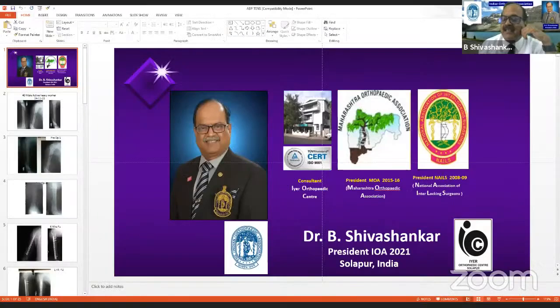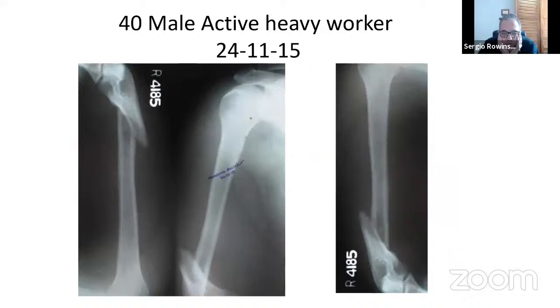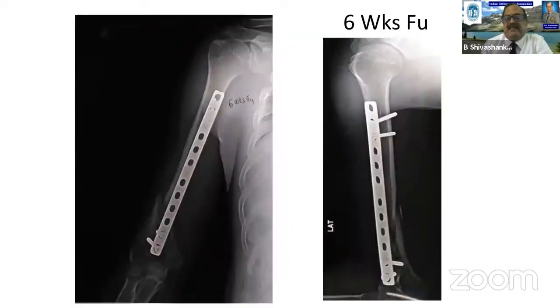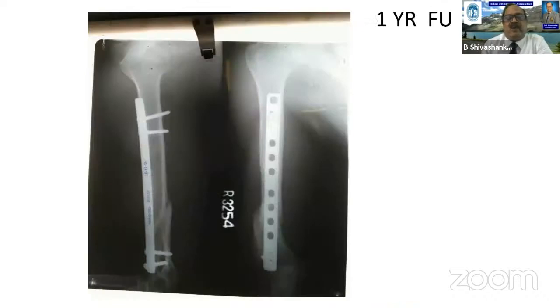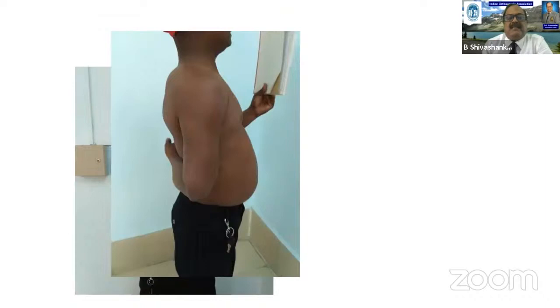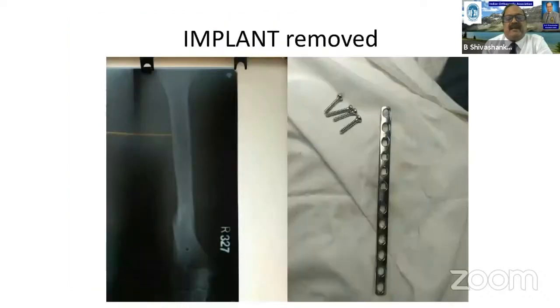Okay. I'll quickly show a few of my cases of anterior bridge plating. Again, a very distal fragment. In 2015, I operated, and you can see the small fragment distally. I just got 2 screws, as Dr. Sergio was telling. This is at 6 weeks. The patient was very happy, and this is at 1 year follow-up. The fracture has beautifully consolidated, and at 14 months the patient came for follow-up. You can see the nice consolidation, and as I said earlier, I normally remove all the implants. The function of the patient is an excellent result, with all shoulder movements and a small incision, and I have removed the implant in this patient also.